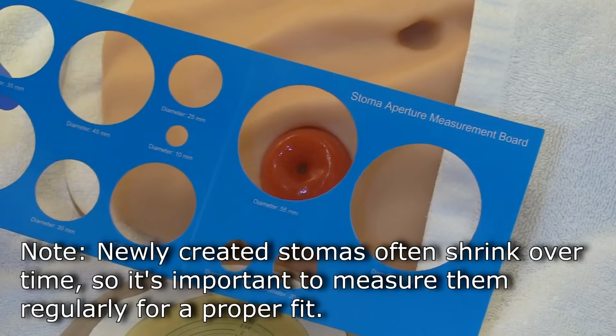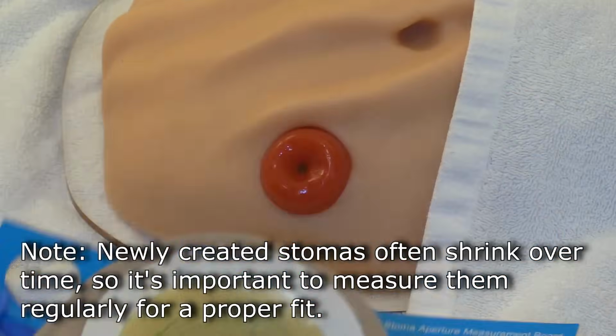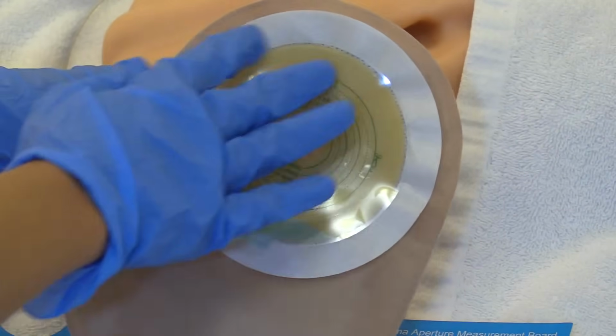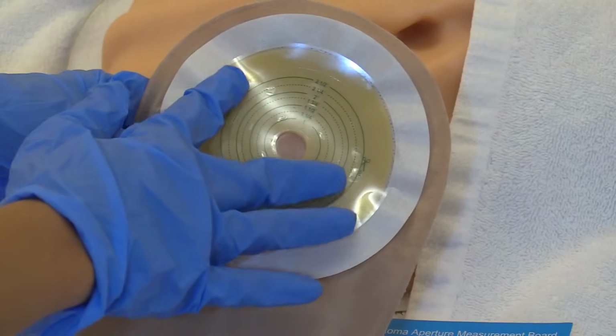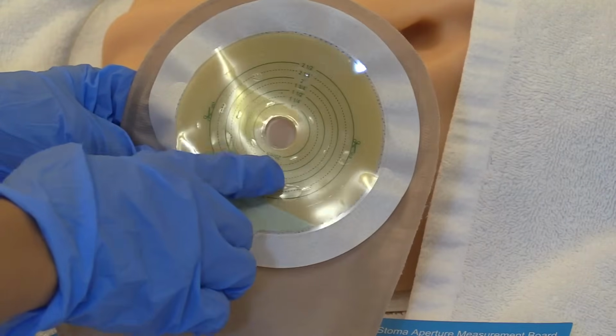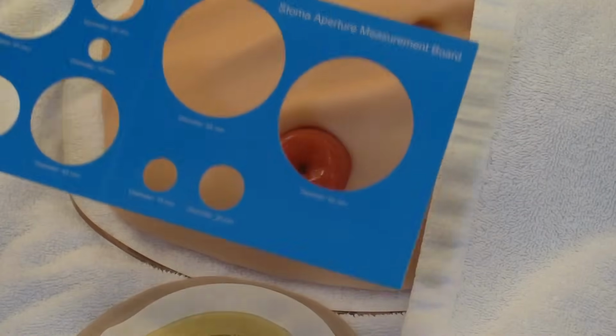Now we're going to measure our stoma using our measuring card. And the reason we want to do this is because we're going to be cutting a hole on our skin barrier. And this is going to be going on the skin, and we don't want to cut it too big where stool will leak onto the skin, or cut it too small where it will constrict the stoma. So we want to measure appropriately.